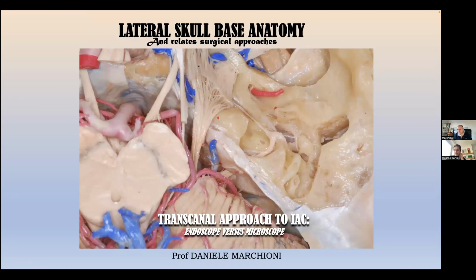A couple of questions. As you said before in the beginning of the presentation, the lateral corridor is like the anterior corridor for the anterior skull base surgery. Have you tried with the enlarged approach, the microscopic enlarged approach, then to use a four-hand technique with the endoscope and two surgeons? Yes, when I'm doing endoscopic transpromontorial approach, sometimes if you have some adhesion, for example, from the disease to the facial nerve requiring a two-hand dissection, one of your assistants can hold the endoscope and you can dissect with two hands.